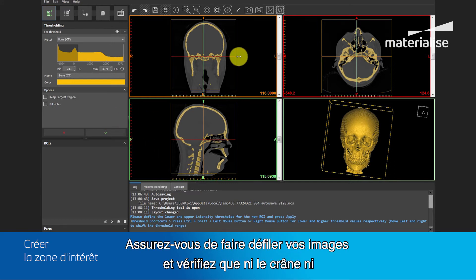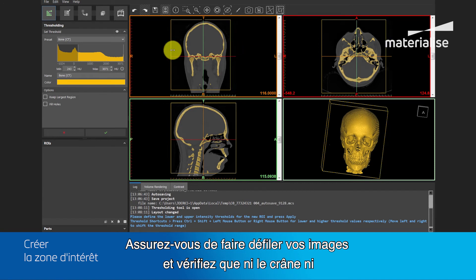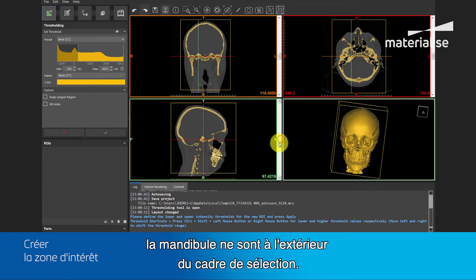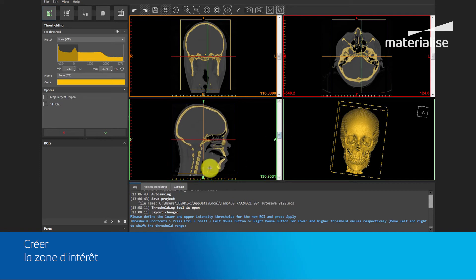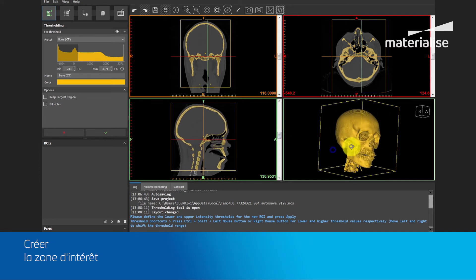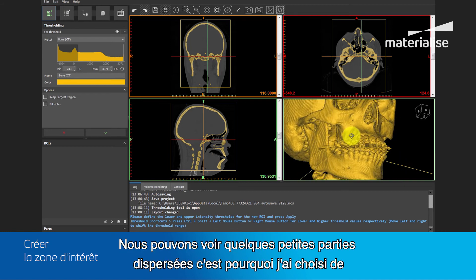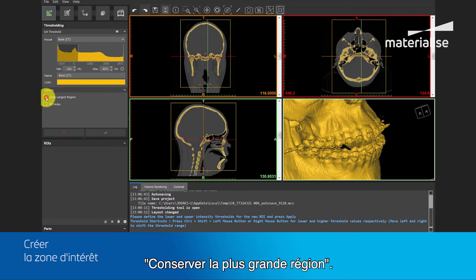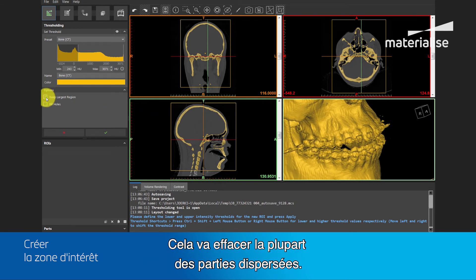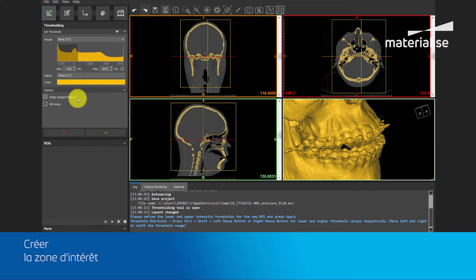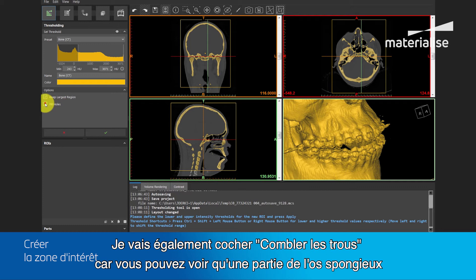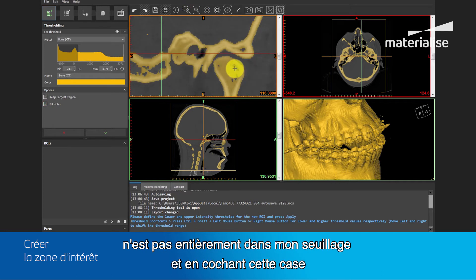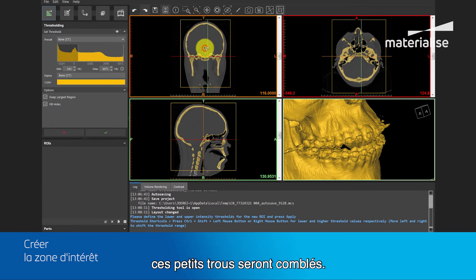Make sure you scroll through the images and verify that neither the cranium nor the mandible are outside the bounding box. We can see some floating scatter present, and that's why I choose to keep largest region. This will delete most of the floating scatter.